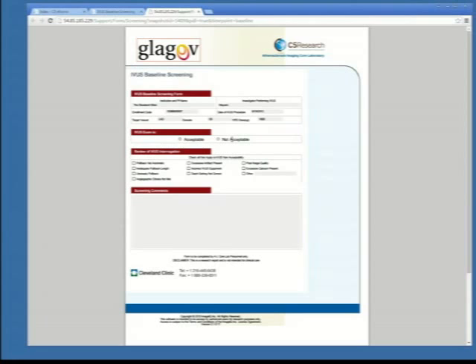So when you move into this review of IVUS interrogation and you have these checkboxes, you can start asking questions for the next trial or the next phase or the follow-up. It says, listen, it's the old Pareto analysis, right? 80% of our imaging experience is failing because of 20% of the problems. Okay, maybe we can improve training. Maybe we can improve compliance somehow. It takes people, money, time, and frustration.